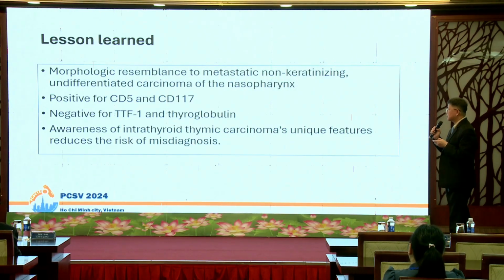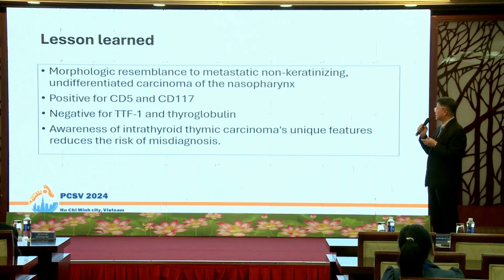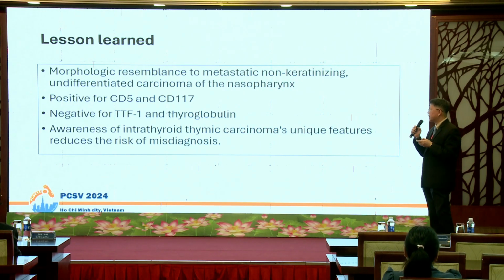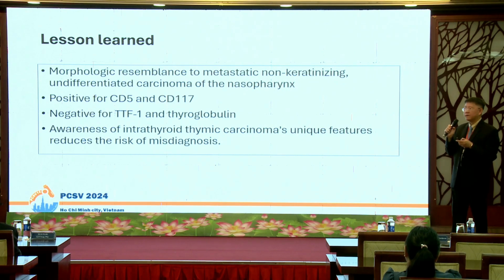So the lesson learned from this case is whenever you see a thyroid cancer that looks like non-keratinizing undifferentiated carcinoma of the nasopharynx, always think of intrathyroid thymic carcinoma.